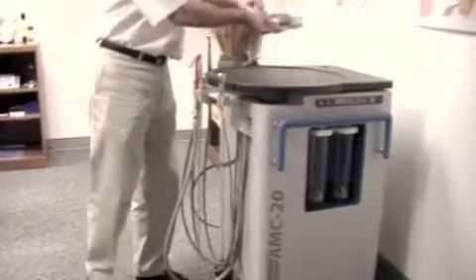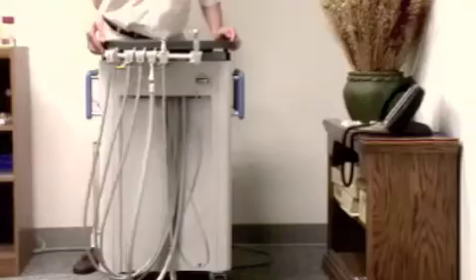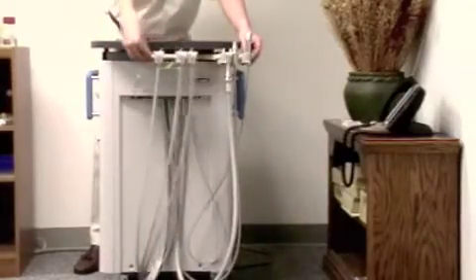Set the wet-dry foot control in the desired position. The instrument holder arms are fully adjustable according to user preference.